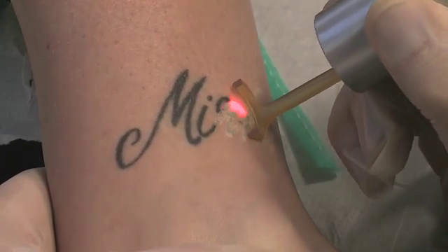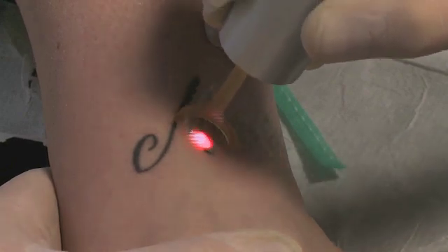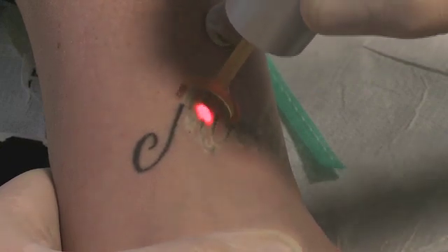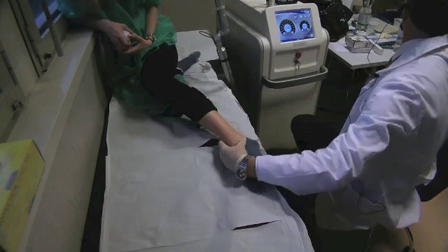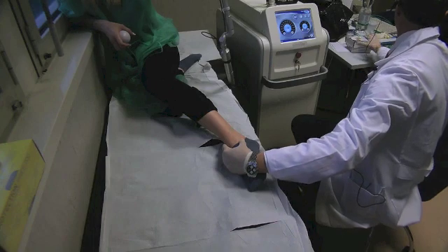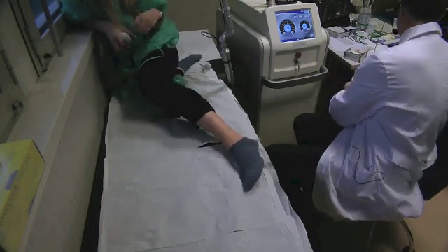How is it? Painful? A little bit, she says. I hope you can see the result — there is an immediate drying of the skin resulting in the whitening. So if we have now a wet gauze — just a little bit of water please — we try to apply a little bit of rehydration.